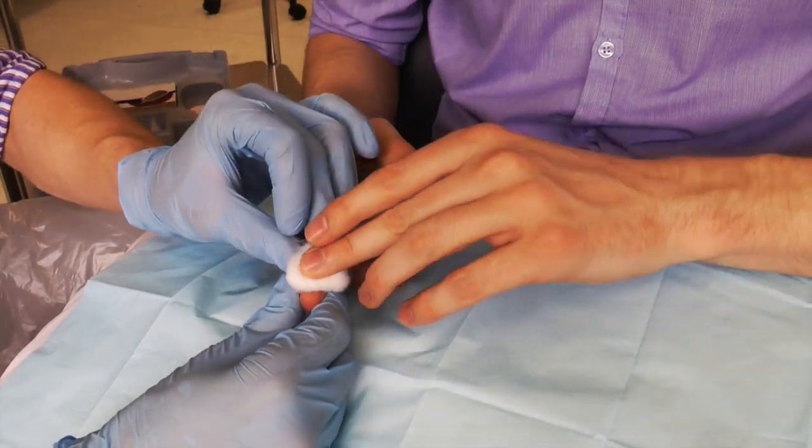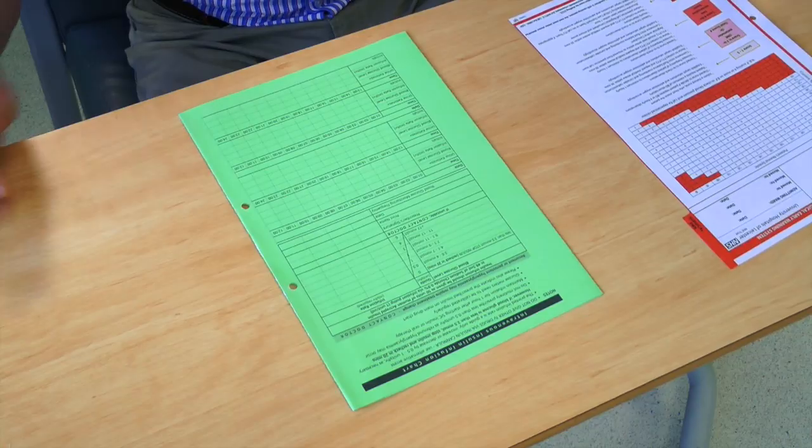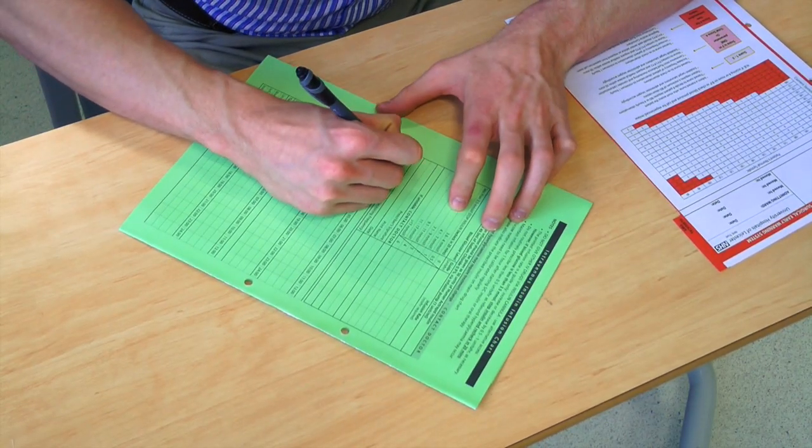Apply a cotton swab to the puncture site. Thank the patient and document the results in the appropriate paperwork.